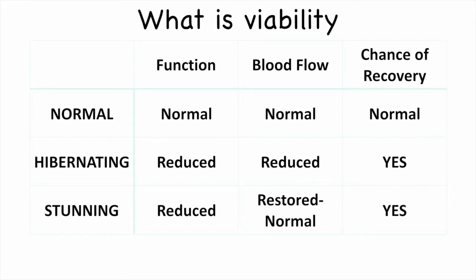Similarly, there is another scenario where the myocardium may be stunned, whereby there was a temporary reduction in the blood flow to that myocardium, which has become normal now, as seen in coronary artery spasm, which spontaneously improves. The function is reduced in these myocardial segments, and they may have reduced function for a period of time as long as 6 months. The recovery of these myocardial segments is also expected to happen.